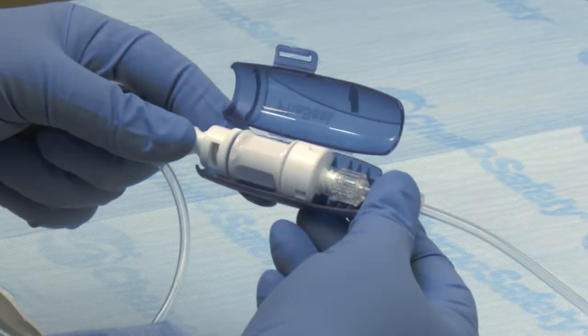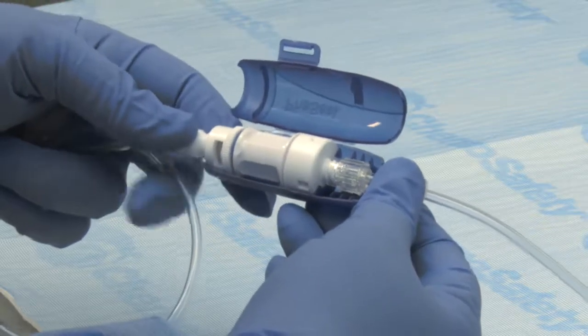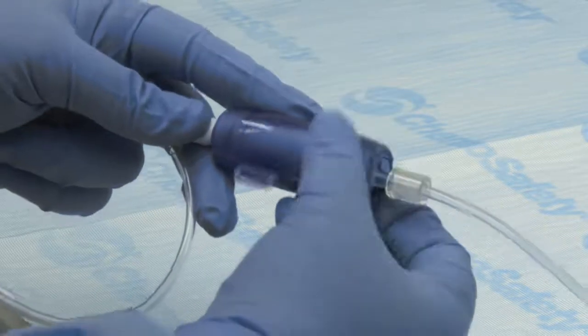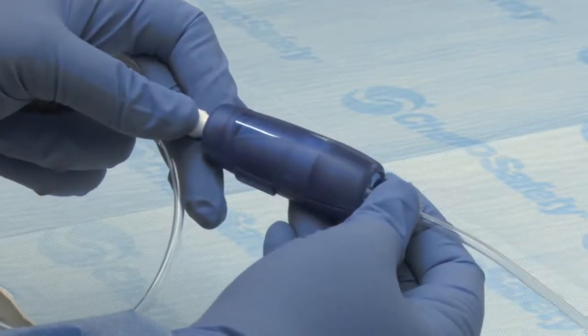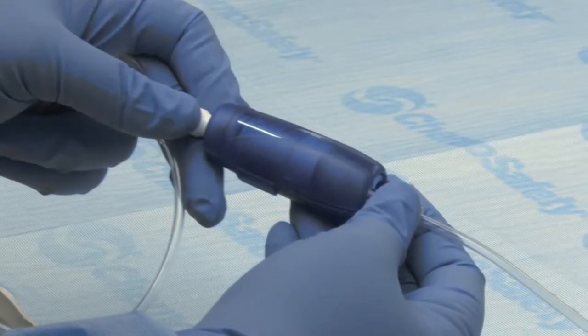Position the BDFACIL infusion clamp around the injector connector assembly with the correct orientation as depicted inside the clamp, and snap it closed, locking the BDFACIL injector connector assembly in place. You may now proceed with the infusion.